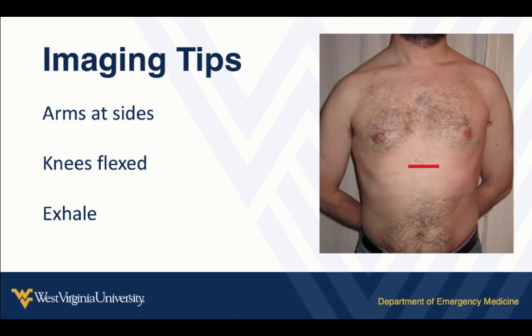We'll do a transverse sweep from the xiphoid. We first identify the aorta and then follow it its whole length in the abdomen from the xiphoid process all the way down until we see it bifurcate into the iliacs. For point-of-care purposes, I really don't think you need longitudinal images unless you see an abnormality on the transverse images.